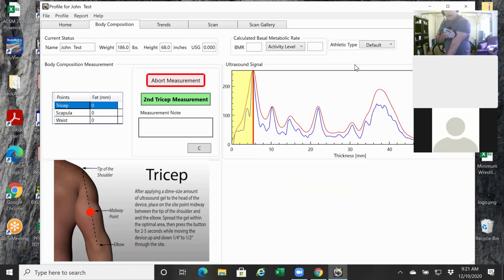At this point, I don't need to double click. I can just navigate while I'm on the skin right back to my start and just press and hold the button down. You can see the speed of it. It's not fast, just nice, smooth, and easy.